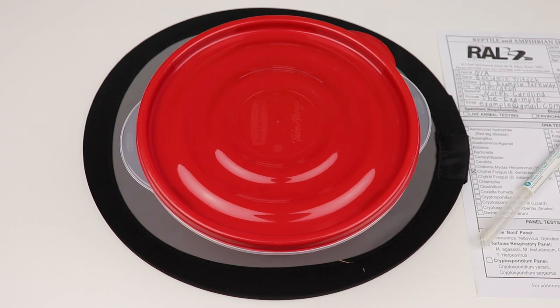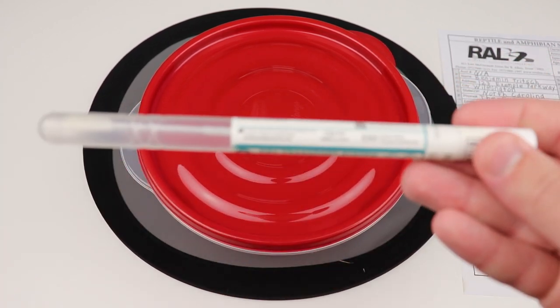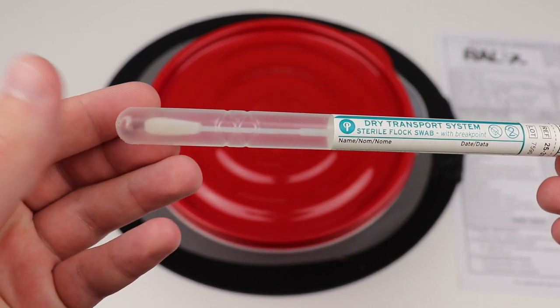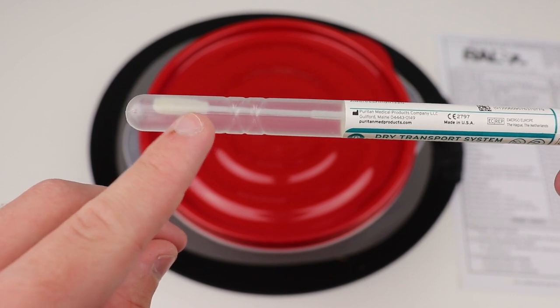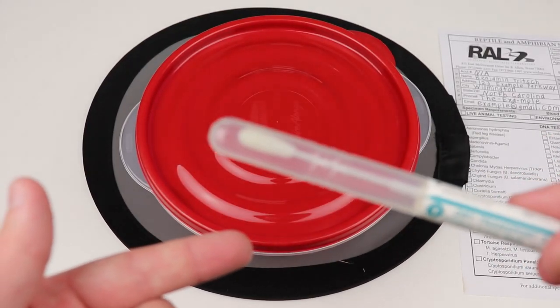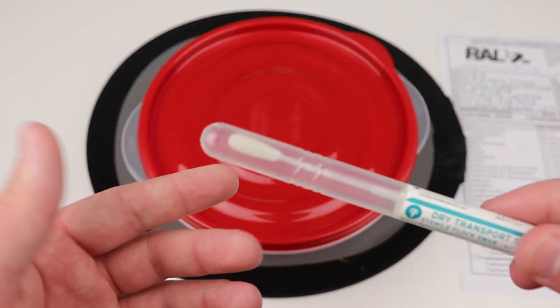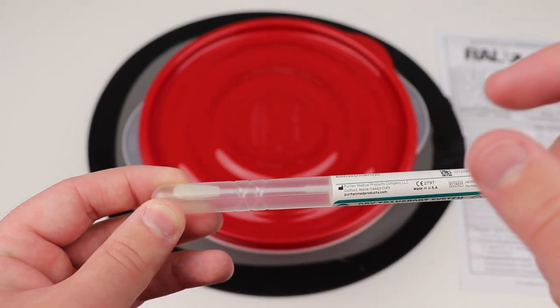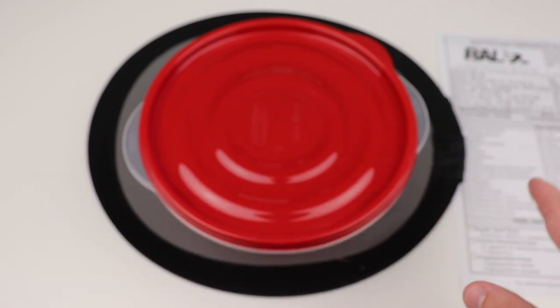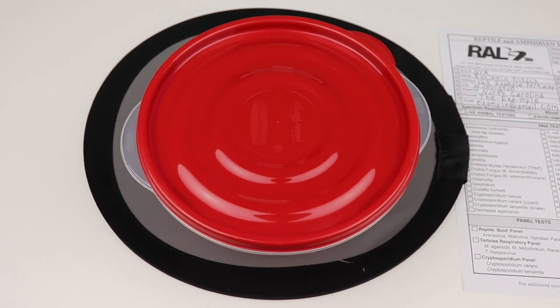The only accurate way to tell whether an animal has chytrid fungus is to do a DNA swab test. You take a standard swab — like what a doctor would use to swab your throat — and swab the skin of the frog, toad, or salamander. This picks up tiny microscopic skin cells. You put it back in the tube, fill out a form, ship it off to a lab, and they'll test whether your animal is infected and send back results via email or phone call.